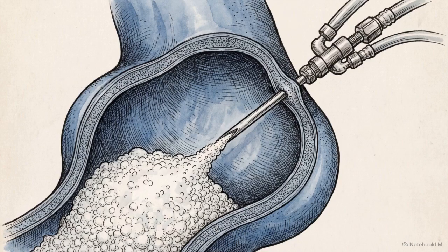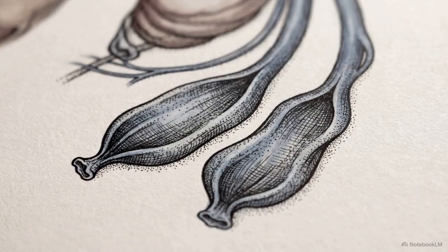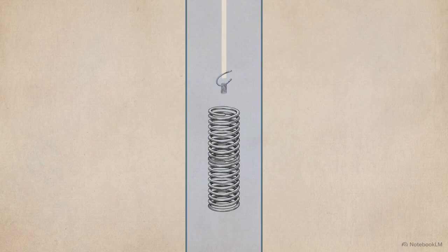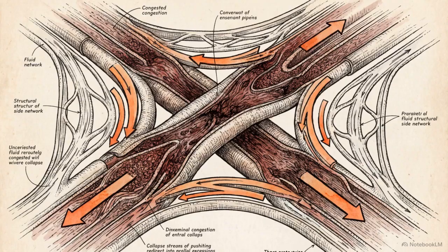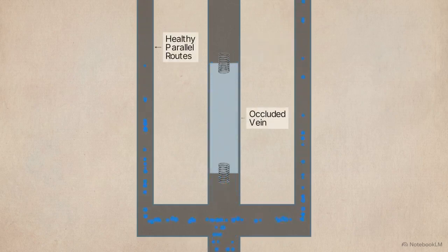First, they inject a chemical sclerosant deep into the varices to collapse the furthest, most abnormally stretched vessels. During the retreat sequence, the operator drops titanium coils as the catheter is pulled back, ultimately capping the vessel's origin point with a permanent occlusion plug. Treating complex pelvic pain is an exercise in rerouting traffic. By selectively destroying failed, leaking pipelines, the body's total blood volume is forced into healthier, parallel routes.